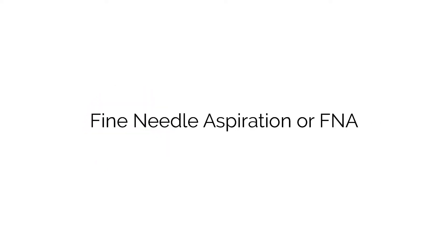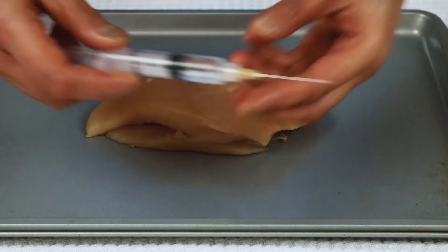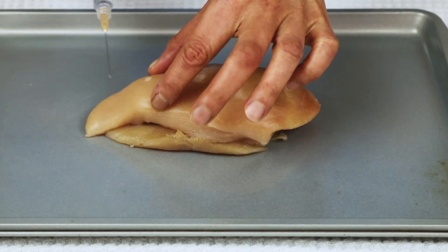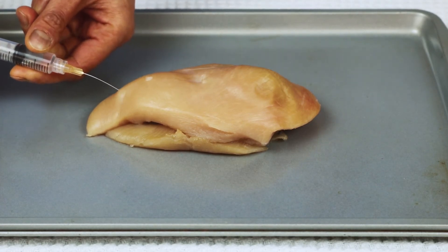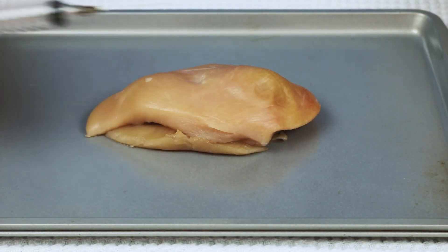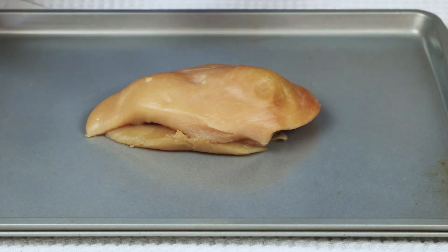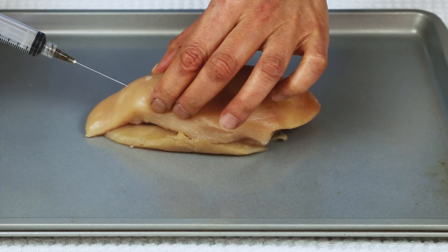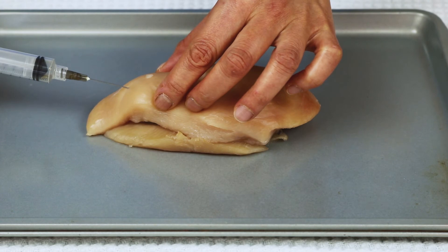Now I'm going to show you the difference between sampling with the trocar and the fine needle aspiration. If you go for a fine needle aspiration, the sampling is slightly smaller. Again we will use local anesthetic to freeze the skin where the needle path will go. Once that is done, we use a fine needle to aspirate the lesion. You will see that the piece that comes out is slightly smaller. We insert the needle and your doctor will have to pass through it many times.